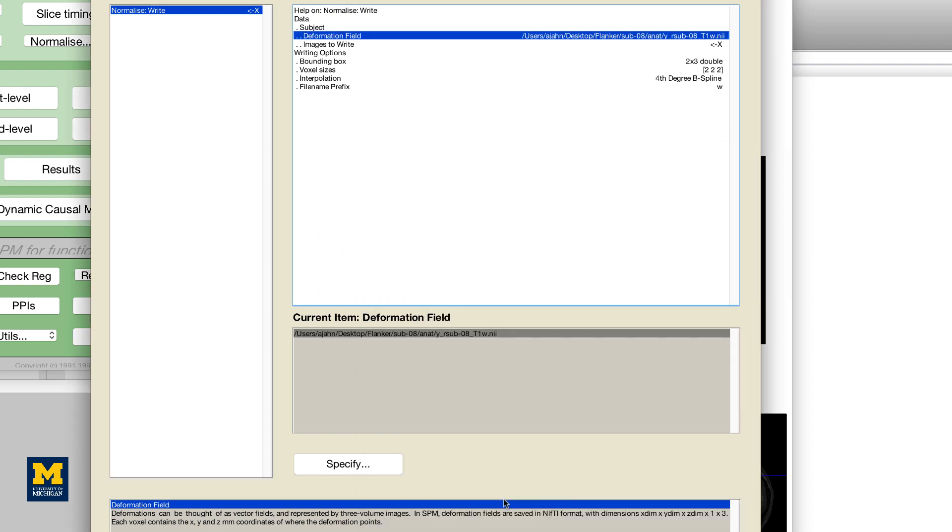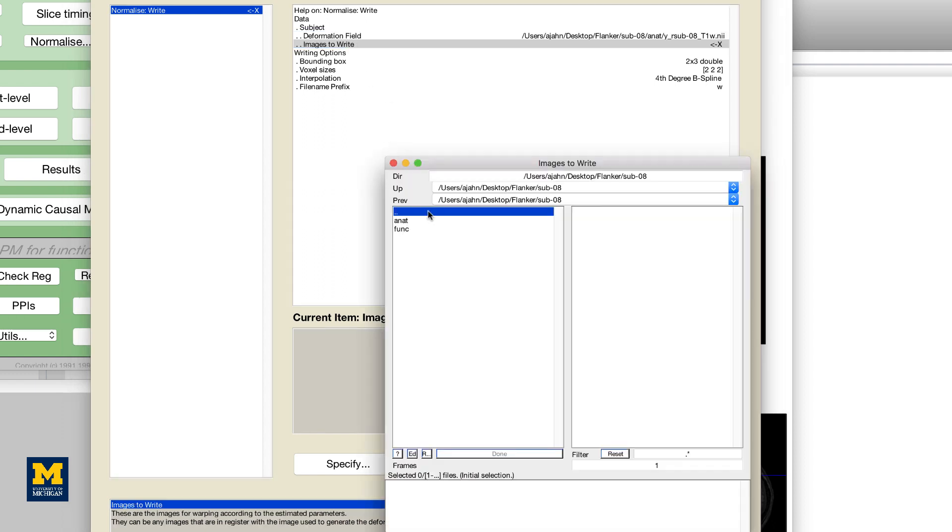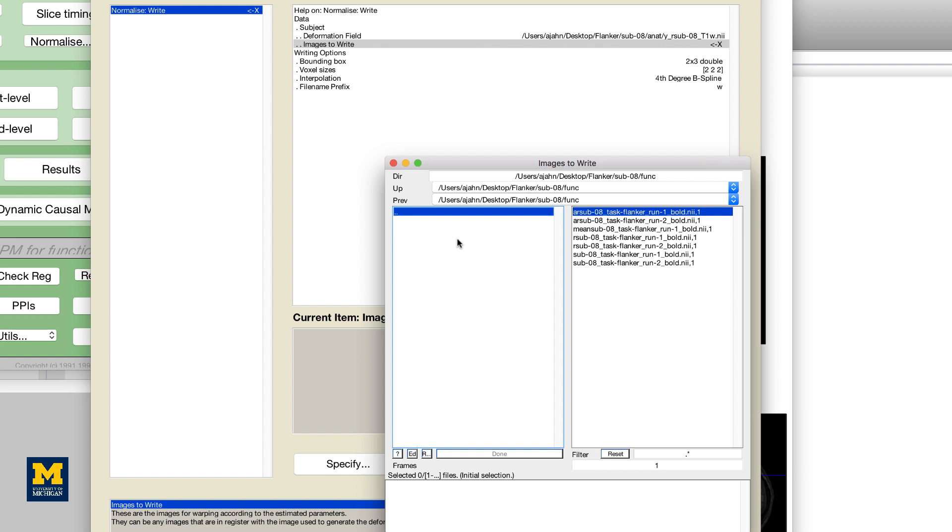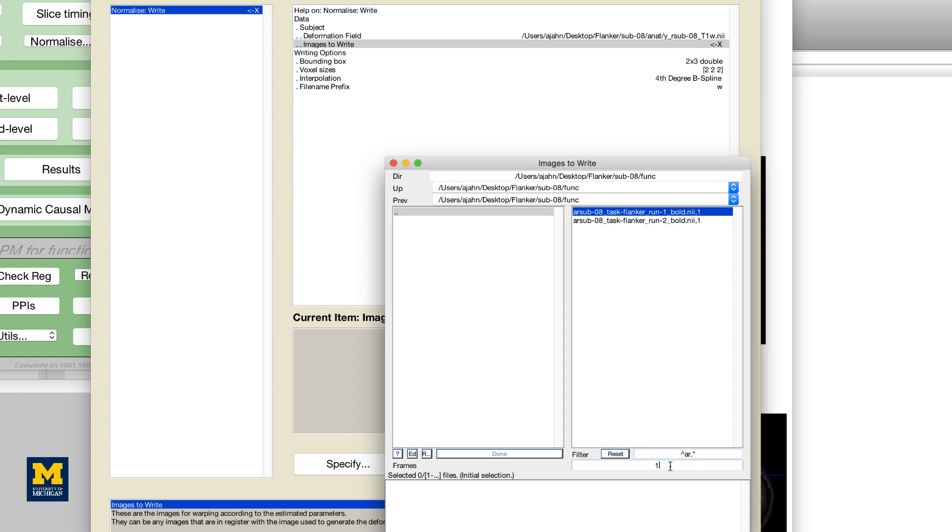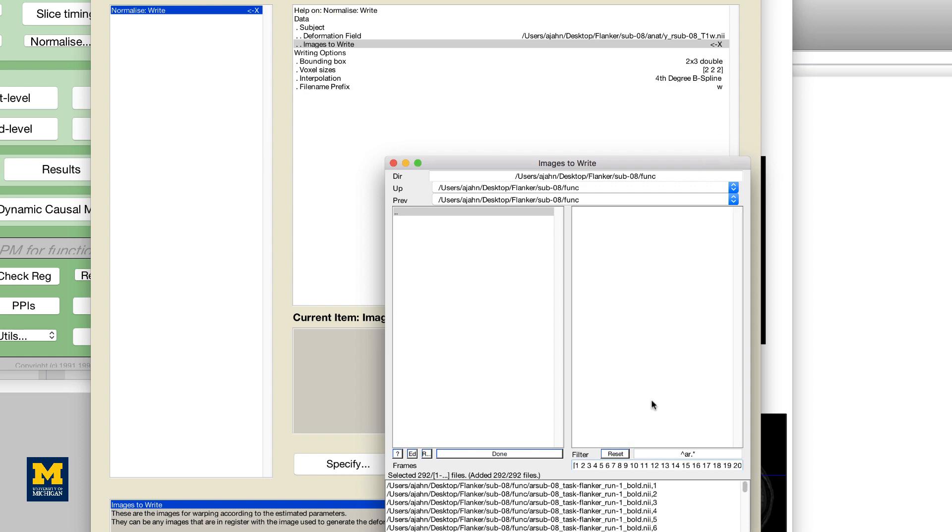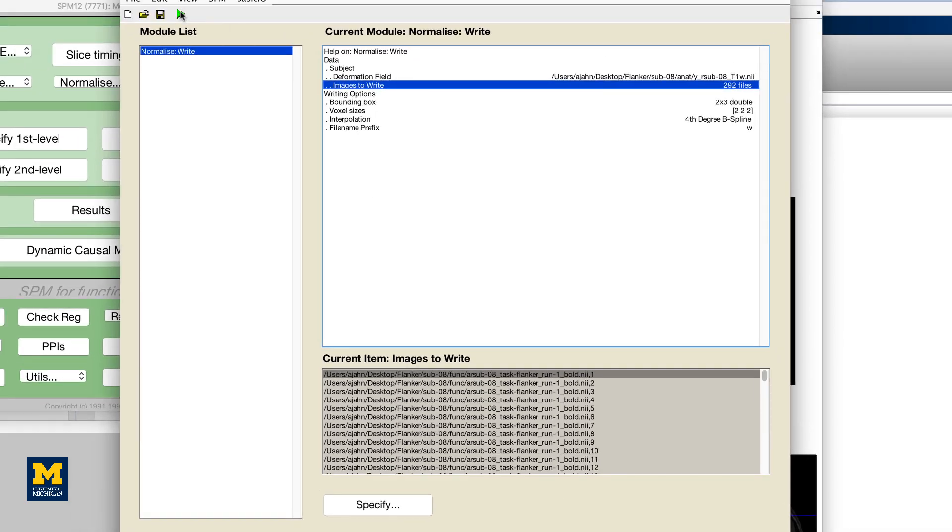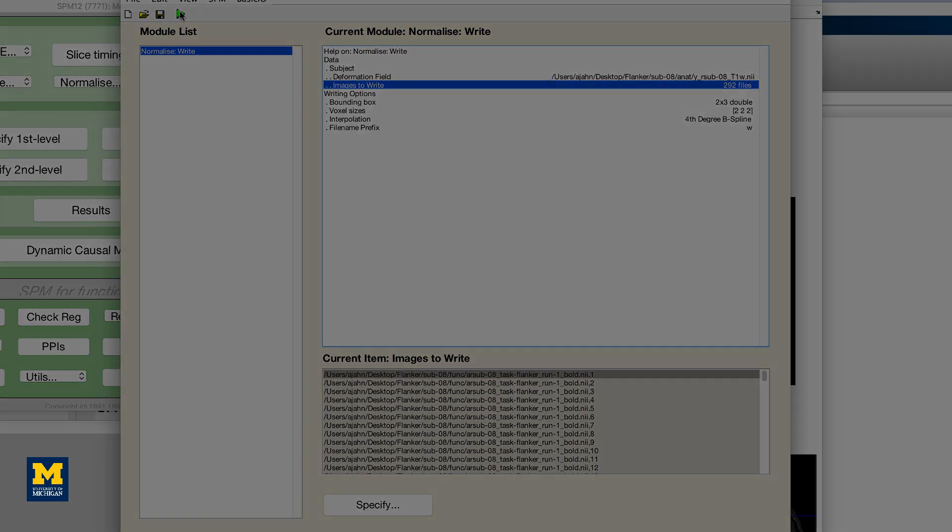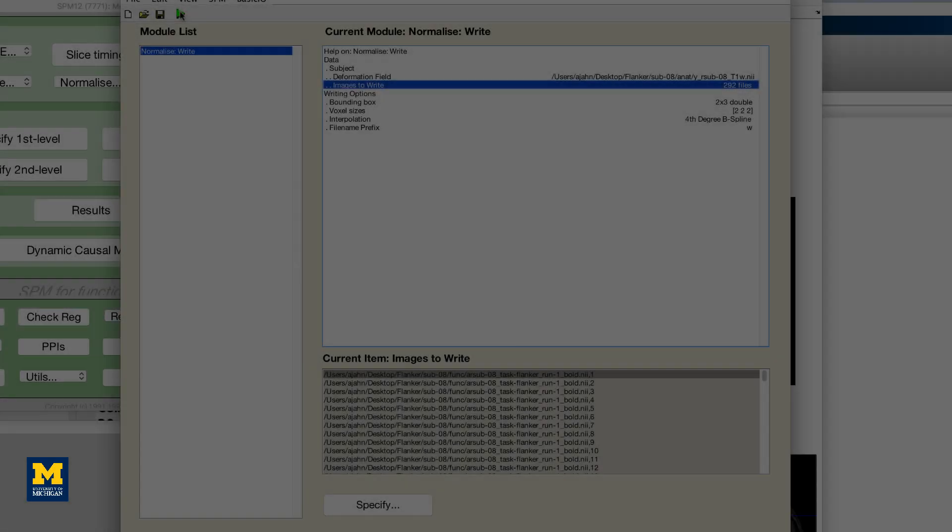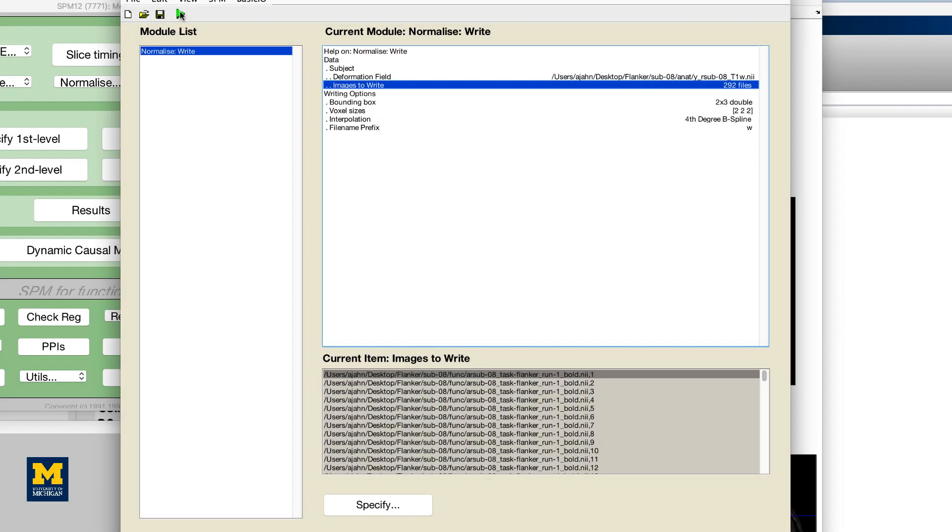And for images to write, select all of the realigned and slice time corrected images. You can do this more efficiently by typing caret ar dot asterisk in the filter field and entering 1 colon 146 in the frames field. Once the functional images have been normalized, check the output to make sure there were no errors.